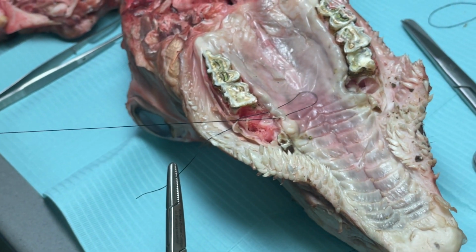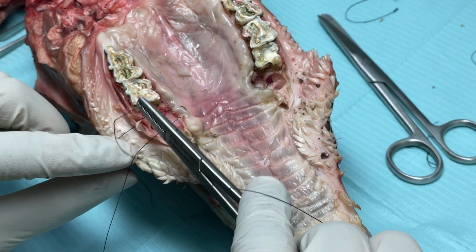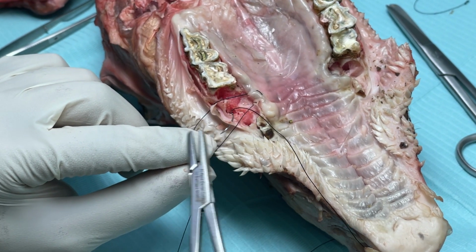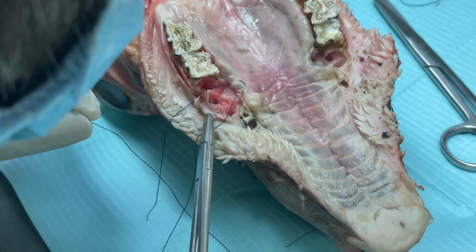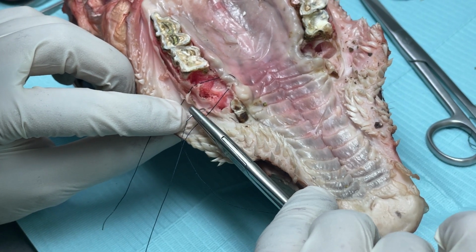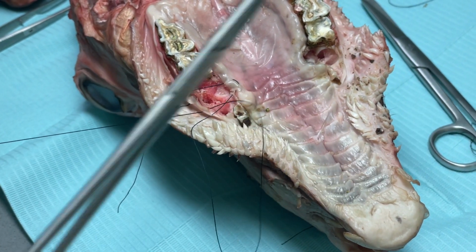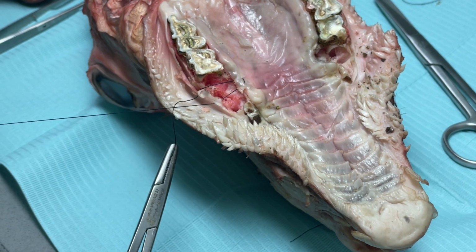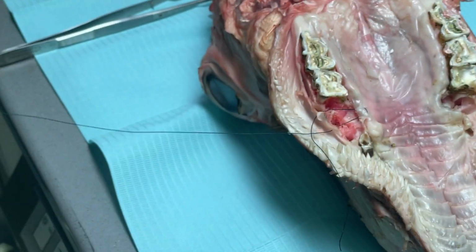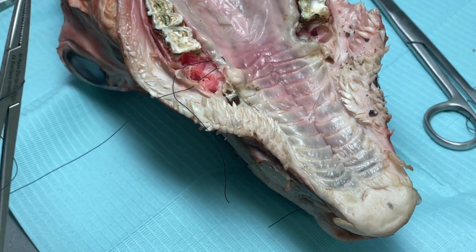Hold it. Okay. Now from the... Hold it. Okay. And so now you see it's become a box. Clear? From here to here, to here, to here, and then you will tie the knot. Clear?